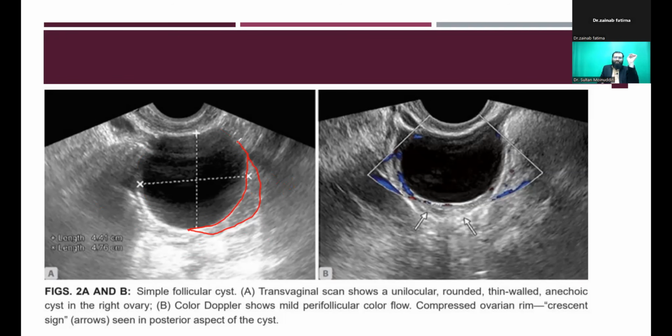So now I ask you the question: is this cyst arising from the ovary or is it compressing the ovary? That means, is it ovarian or para-ovarian? The answer is, it is ovarian. Very good. Why? Because the beak sign is positive. It is making an acute angle. Good, Zainab. Good, Rashmi. As there is an acute angle with the cyst, it means this is ovarian in origin. Again, here you are clearly able to see this beak sign positive.